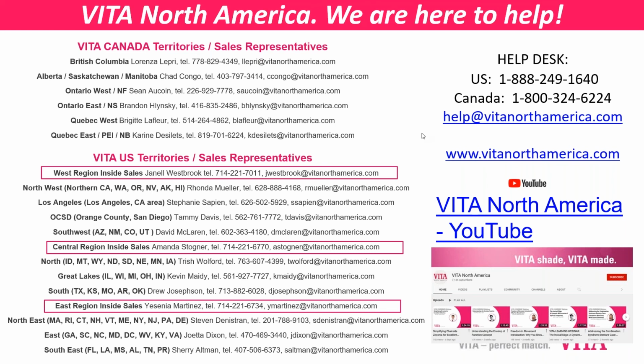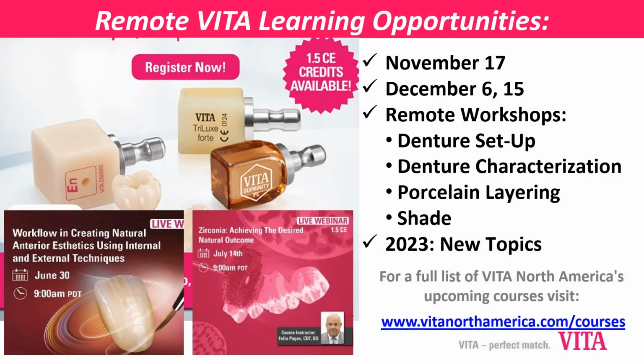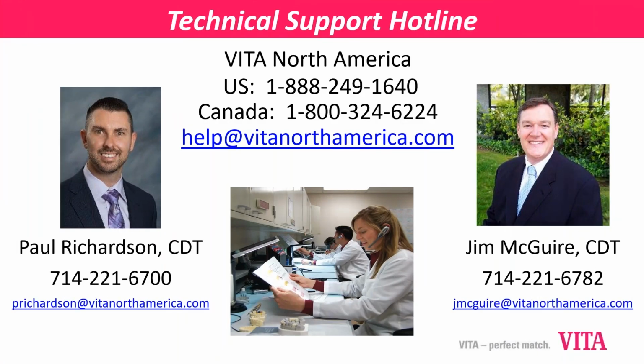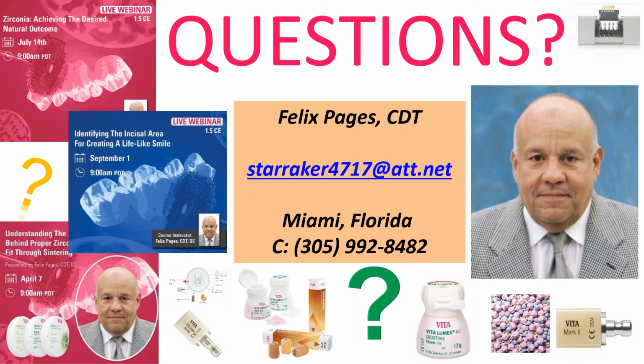So if your target is a 1M1 and it's pretty thick, and it looks too bright, you might have used a 2M1. You see what I'm saying? When you do a full arch, the whole key is knowing what that zirconia is going to look like when you finish. Most people aren't going to complain if their teeth are whiter, but a 1M1 could be awfully bright in the HT. So the ST would be a much better blend.